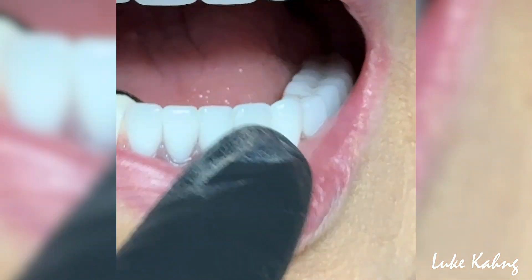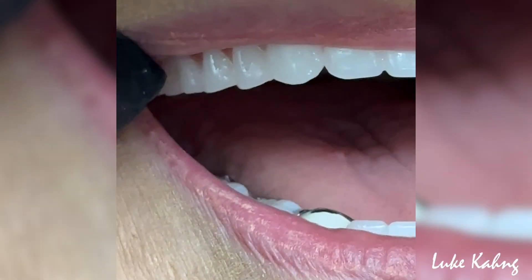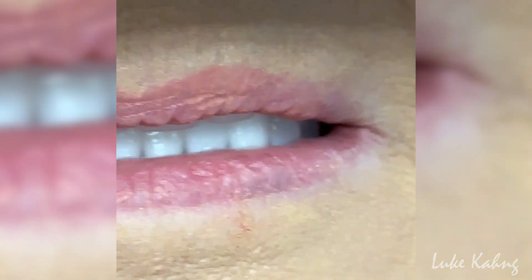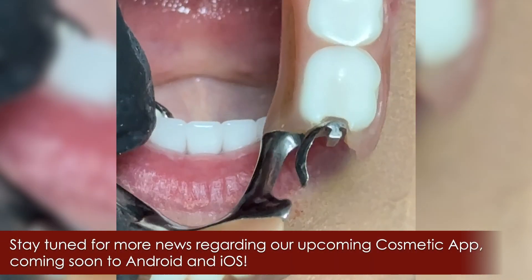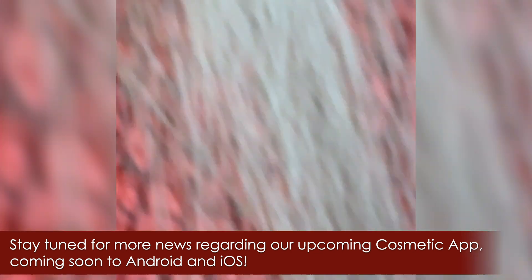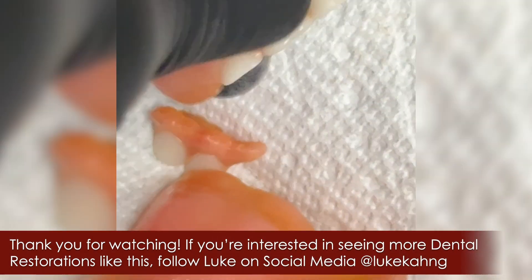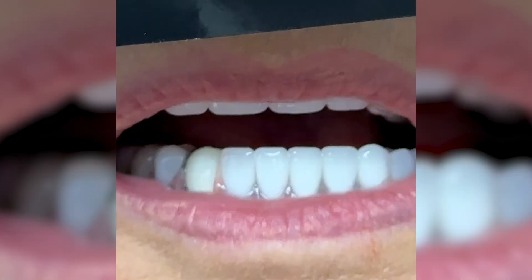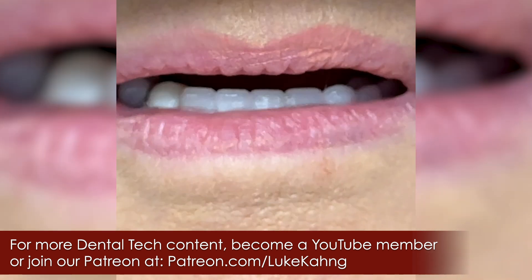That's why we make the open all the way here. We can get the occlusion contact so now she can chew on both sides. This is the before and after — she wears the before, old dentures, and here are the new dentures fabricated. Let's grind it and bite — that's the final. Alright, so I have to make the dentures comfortable and the partial too.